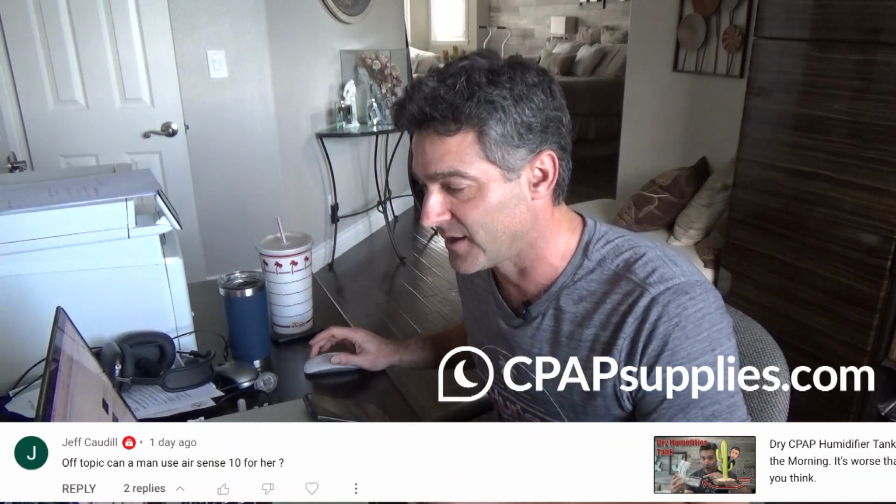Jeff Caudill says, off topic, can a man use an AirSense 10 for her? Now, if you don't know what the AirSense 10 for her is, it's literally an AirSense 10. It just has a different algorithm for the automatically titrating portion of it. And what I mean by that is it's very gentle in its adjustments. Let's take a quick look though.